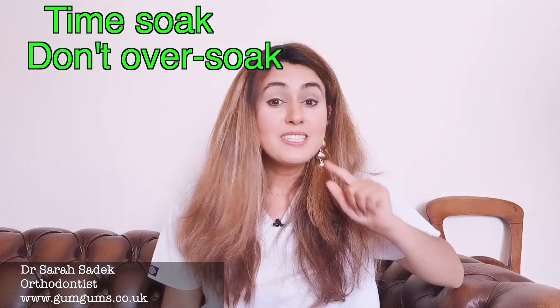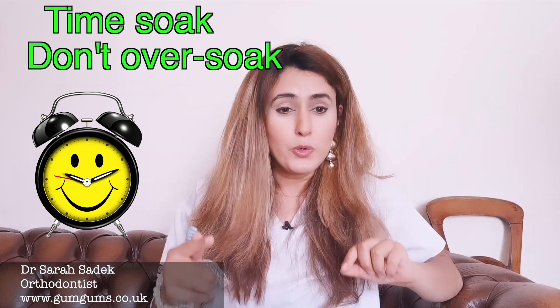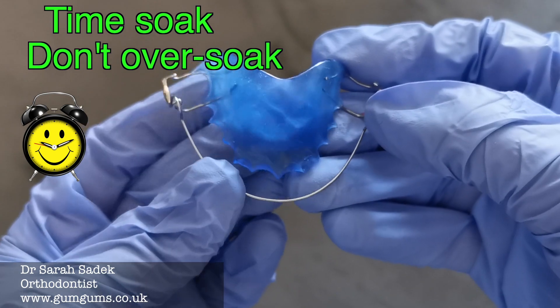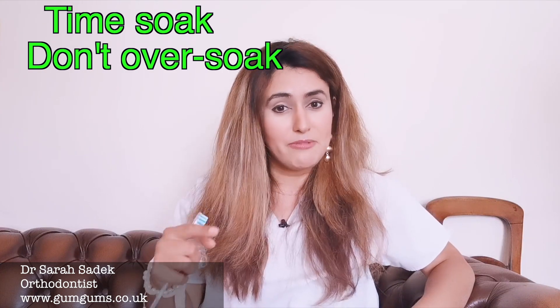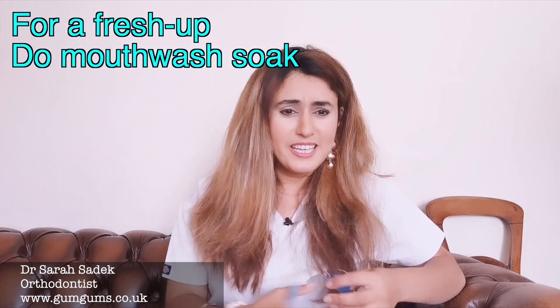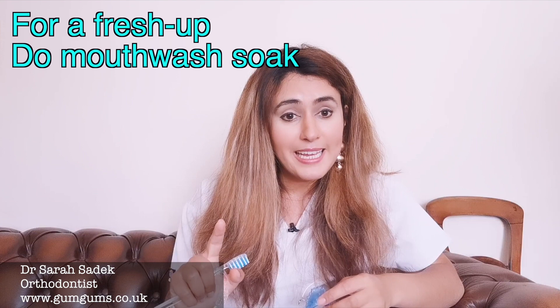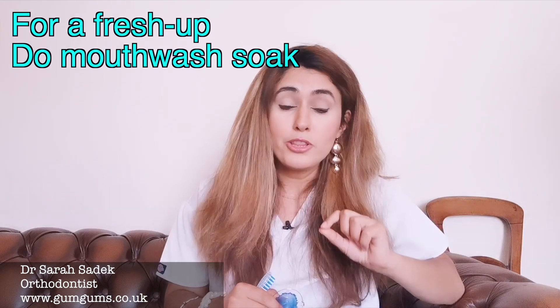Next top tip: time your soak. If you choose to use tablets, don't soak a Hawley's retainer for too long, because it has metal components and soaking them too long can corrode the metal. Only soak the retainer for the time it takes to clean it, or as long as is specified on your cleaning tablets. Another top tip: if you want to freshen your retainer's smell and kill some of the bacteria, you can do a quick mouthwash soak. However, if your mouthwash contains alcohol, only soak your retainer in this type of solution occasionally, as alcohol can harm the retainer's plastic.